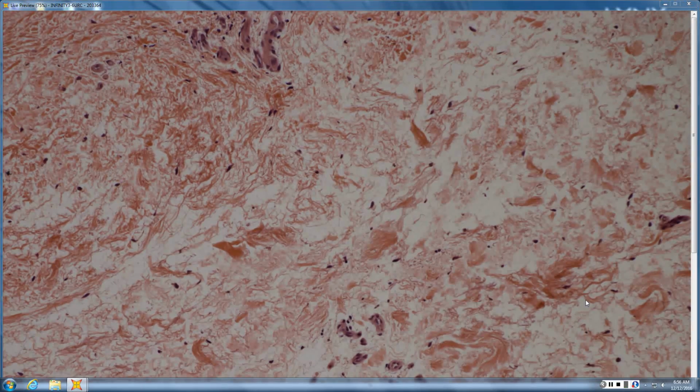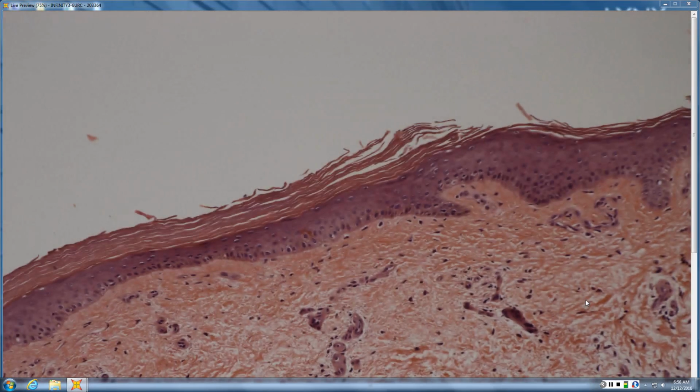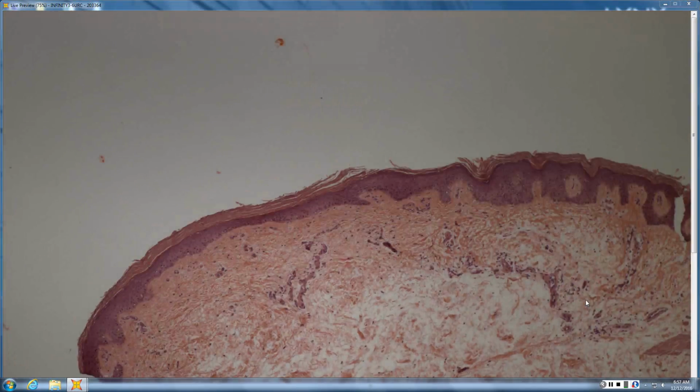And then stasis mucinosis was in the differential in the book. And that's just more superficial. The blood vessels up here do look a smidge thick, but you'll get more of your actual stasis changes where you get those really rigid, nodular superficial blood vessels and that sort of thing too. So, good.